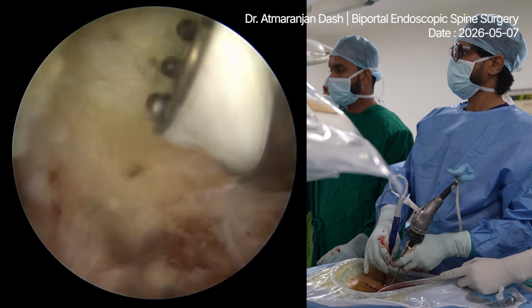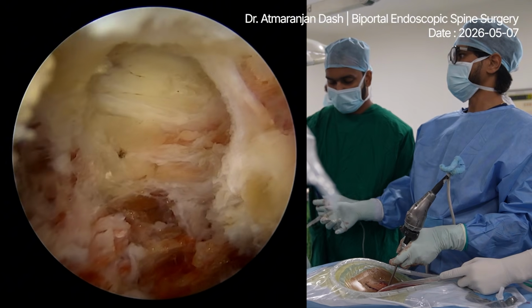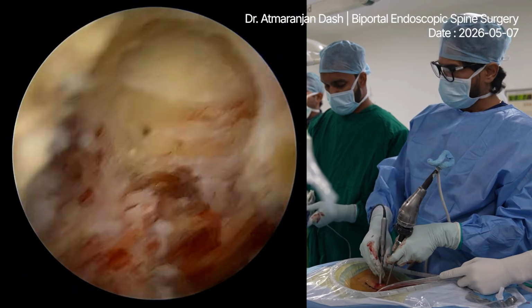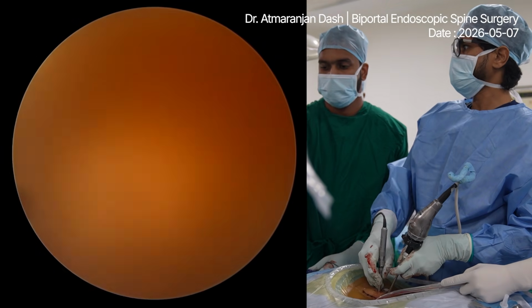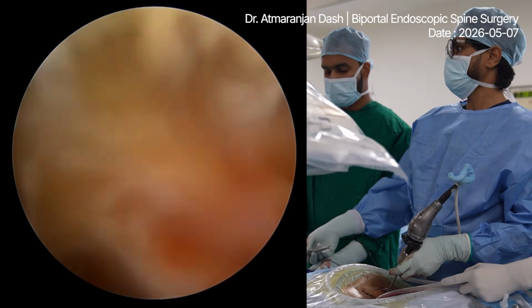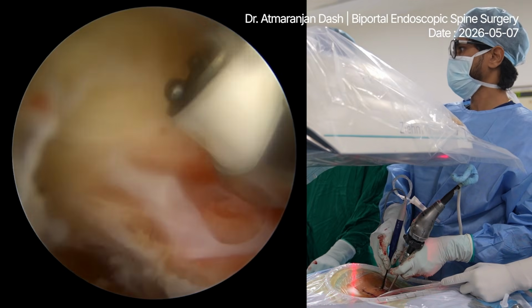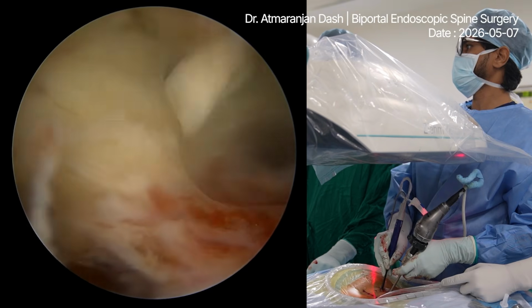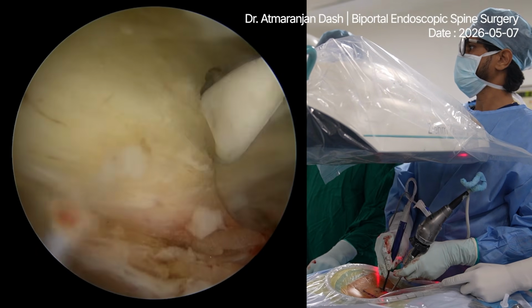You can see very well. Stop. Drill, please. Take out this. Bring the C-arm in, just to see where exactly the foramen is. Coagulation. You see a lot of vessels. Coagulation. So revision cases are wonderfully done with biportal, especially the foraminotomies.